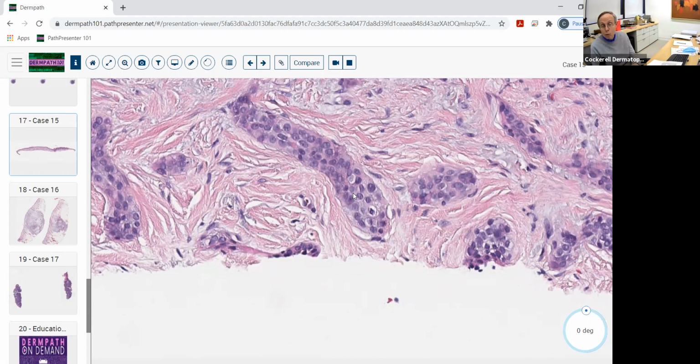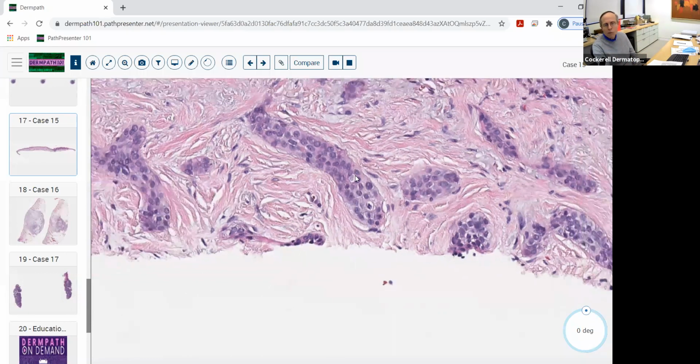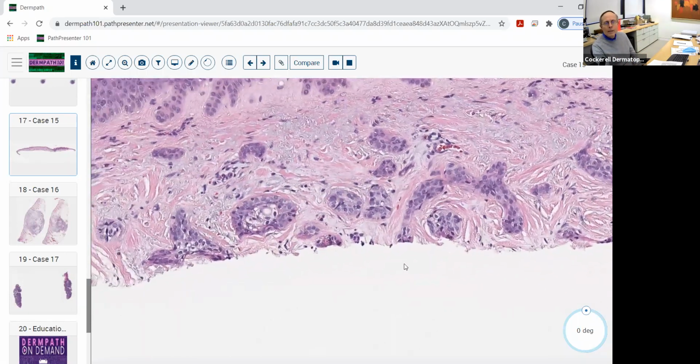Probably of that one, the answer is most likely no, because that one usually gives you small little cysts with calcification. So I think usually in a shaved biopsy, when you see areas of small cystic calcification and small little follicular germ structures, you can most of the time diagnose that on an inadequate shave biopsy, or you can suspect that in that situation. But here, this is the surface of a microcystic adnexal carcinoma, and you can't make this diagnosis with certainty here. So unfortunately, we can't really do it.